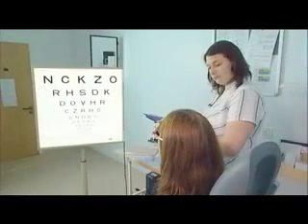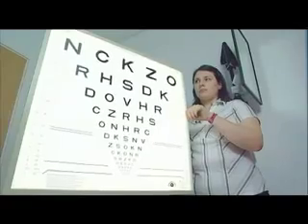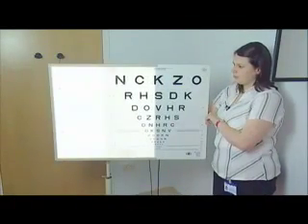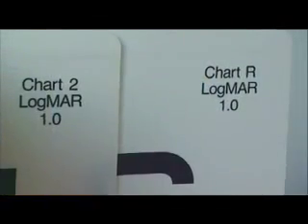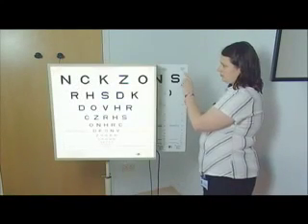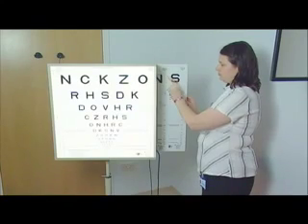The method is highly standardized and has been adopted generally for vision research. ETDRS letters are presented at high contrast on a backlit screen, illuminated by a stable and diffused fluorescent light source. Three charts are available: the R chart is used to carry out a manifest refraction, while charts 1 and 2 are used to assess right and left visual acuity, respectively.